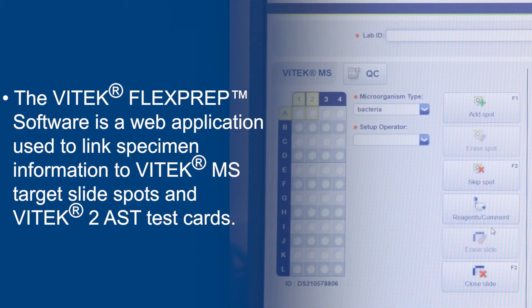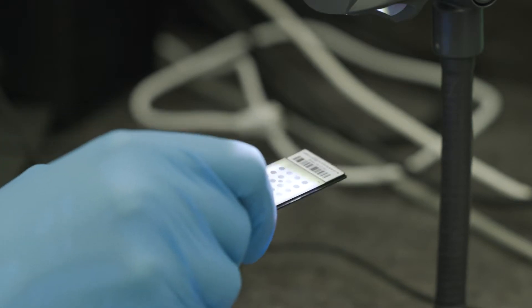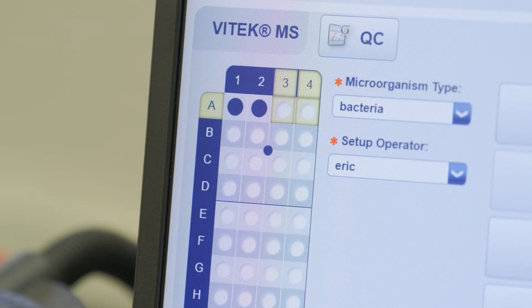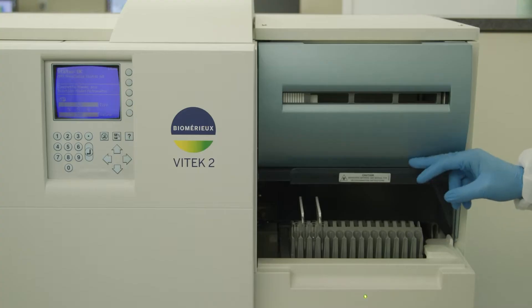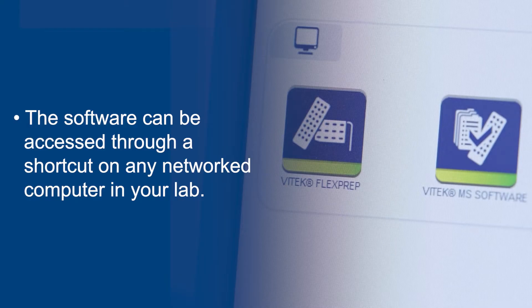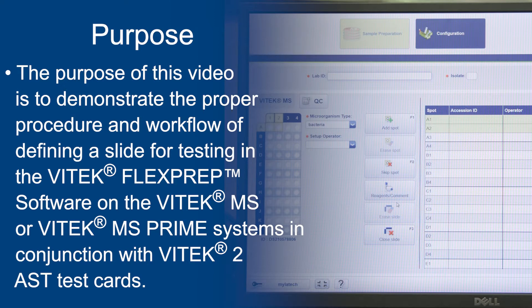The Vitec FlexPrep software is a web application used to link specimen information to Vitec MS target slide spots and Vitec 2 AST test cards. The linked accession ID, cassette information, and Vitec MS target slide spots can then be transferred to the Vitec MS or Vitec MS Prime and Vitec 2 systems. The purpose of this video is to demonstrate the proper procedure and workflow of defining a slide for testing in the Vitec FlexPrep software on the Vitec MS or Vitec MS Prime systems in conjunction with the Vitec 2 AST cards.